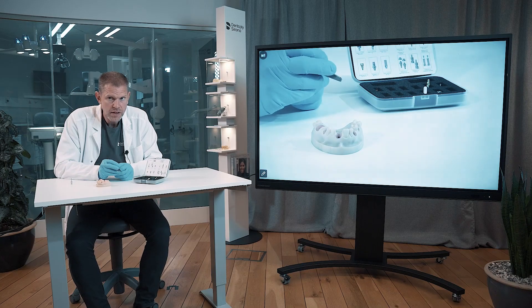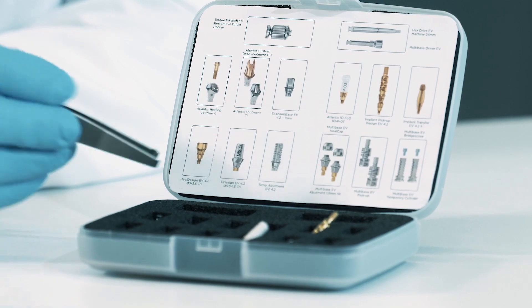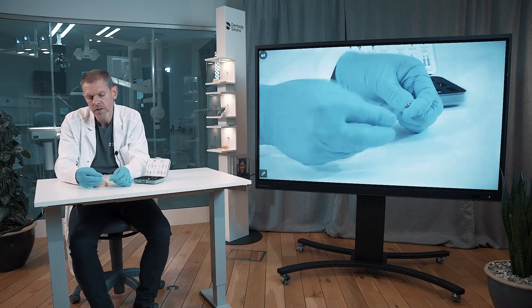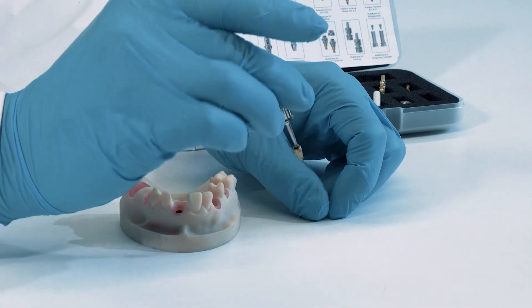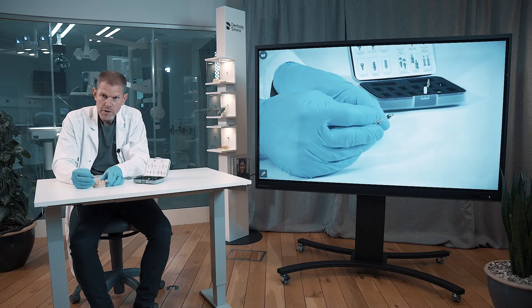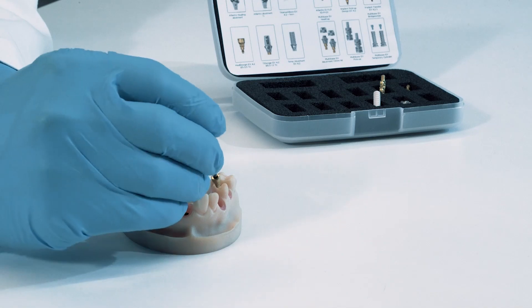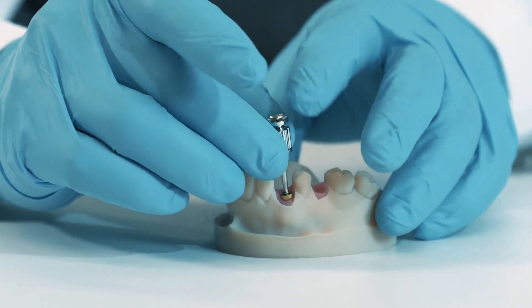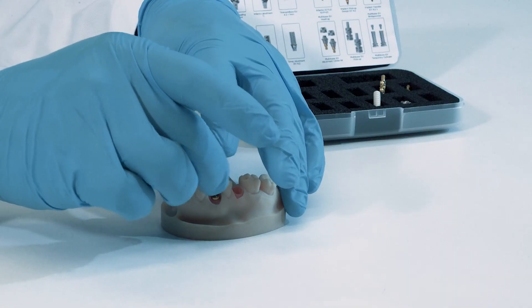The second healing abutment is the Healdesign EV, as you can see here — it's in this compartment. The screw is integrated together with the body of the abutment, so it can't come off; it's very safe. It is triangular, meaning you have one of the flat sides that should face buccally. Once you find the correct position, you start screwing it down into the implant.